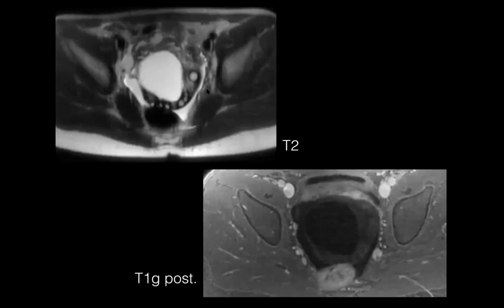So here's the MR images that we got afterwards. There's 2 types of images. This is a T2 weighted image, fast spin echo, axial, and the fat is bright. There's no fat suppression. And what you're seeing here is a large ovary, right? This is way too large for a 3-year-old, and there's a large cyst in the middle of it.